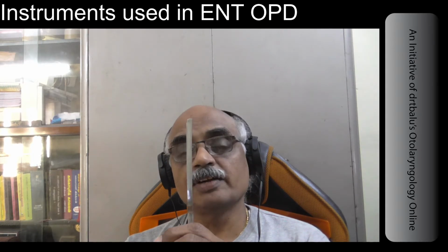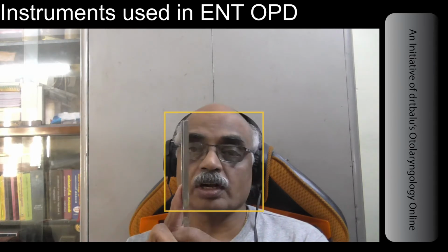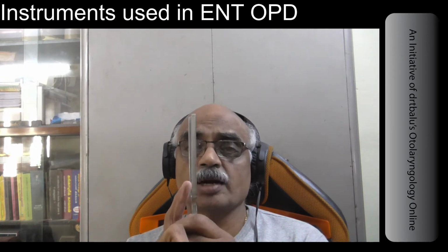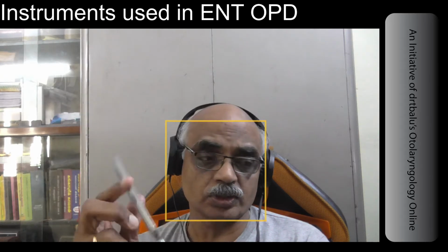There are certain prerequisites which are necessary to ensure that the tuning fork is a good one. It should be made of a good alloy. It should vibrate at the set frequency. It should maintain the vibration for one full minute, and it should not produce any overtones. So these are all the prerequisites for an ideal tuning fork.